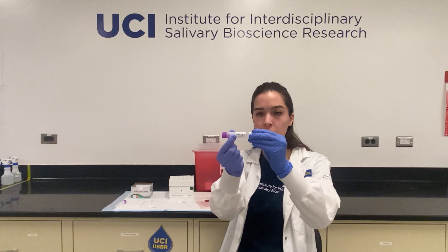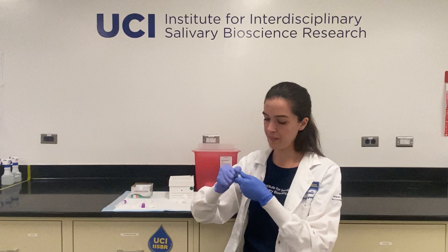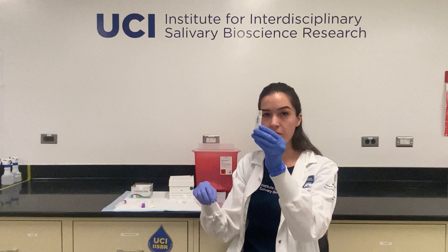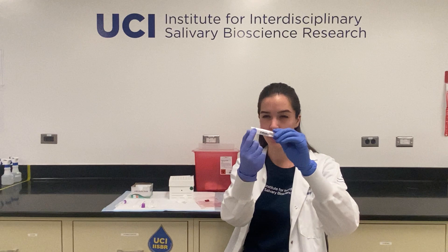You'll notice that your tube is broken up into three parts. You have the cap, you have what we call the basket — this is where your swab will sit — and you have the main tube component. You want to make sure that the label is only on the main tube component part and not so far up that it runs along the basket part as well.